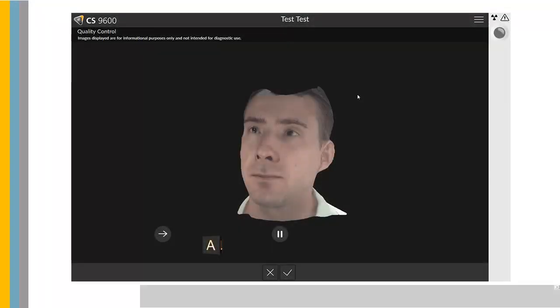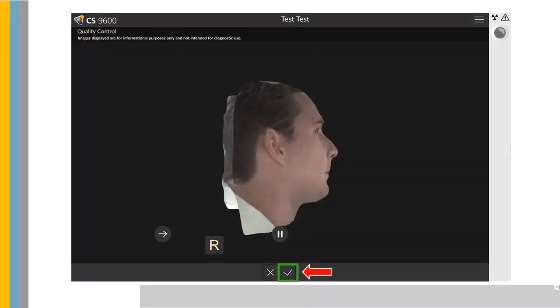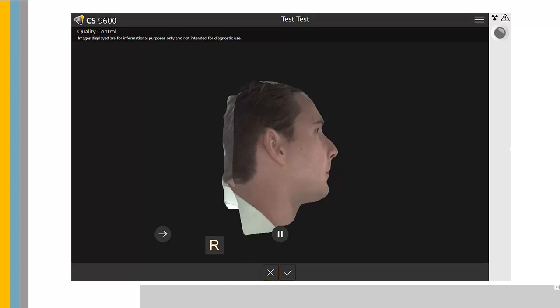When the acquisition ends, the acquired image appears on your screen. Check the image quality. If you are satisfied, select Validate. The image is automatically transferred to the imaging window. If you are not satisfied, select Discard and relaunch the acquisition with the remote control.